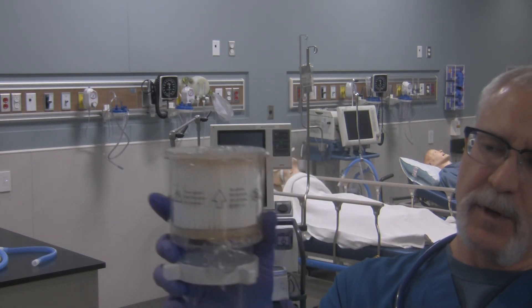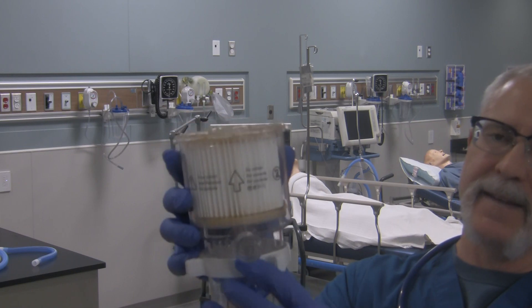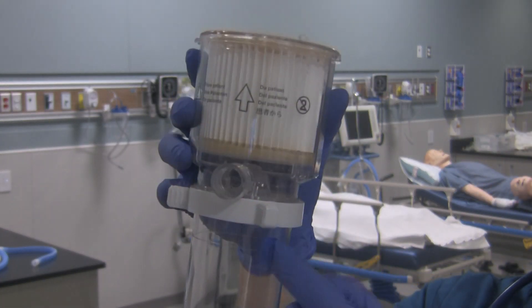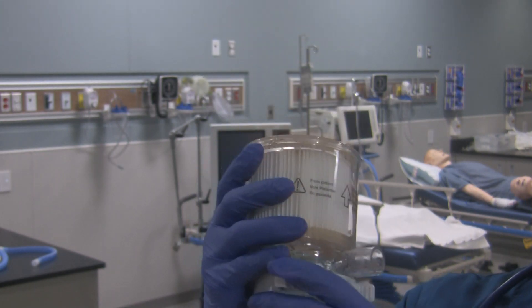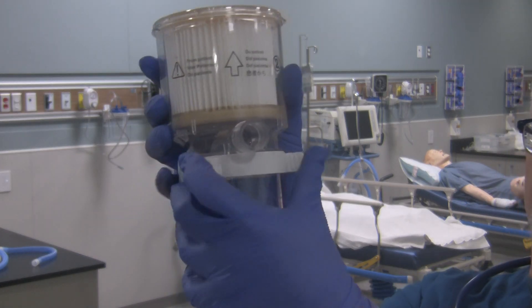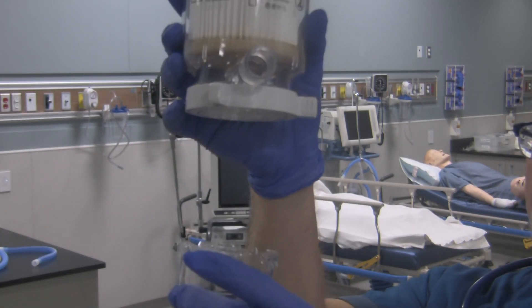So how do you take it apart? Simply hold on to it and then slide this locking ring — the locking ring is this white thing right over here, there's a couple of tabs on it. Just simply slide it over to the left like so, and then the two pieces come apart.